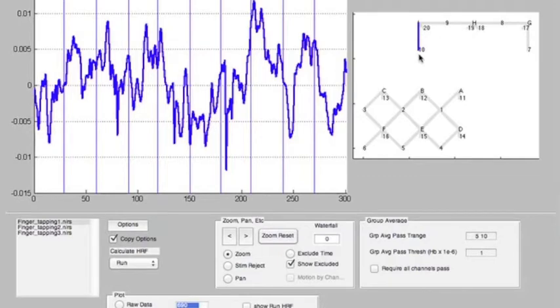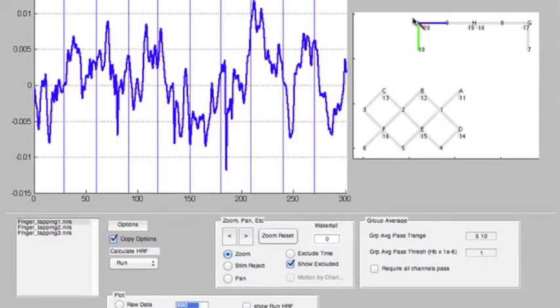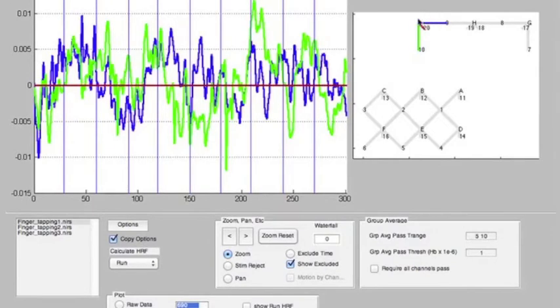If we click near a detector, as we did in this case, you see the channel from that detector with this source. If we click near the source, it gives you all of the channels of data for that source, which was with three different detectors.